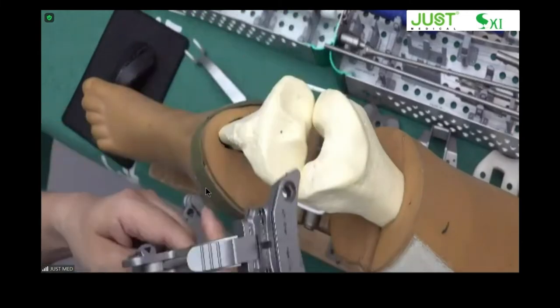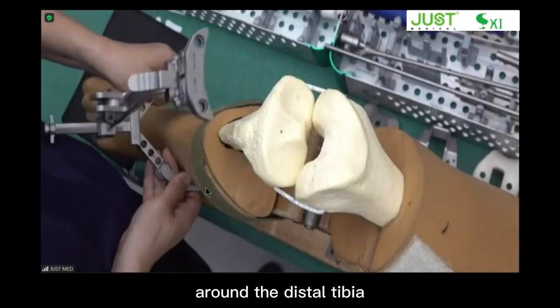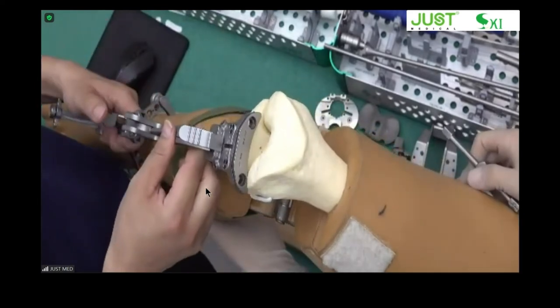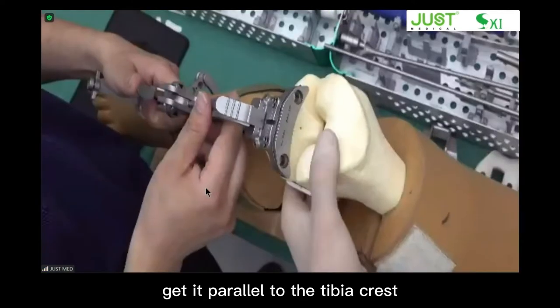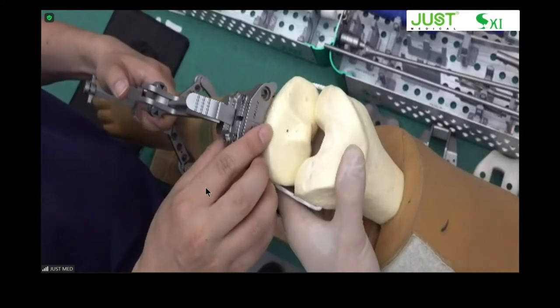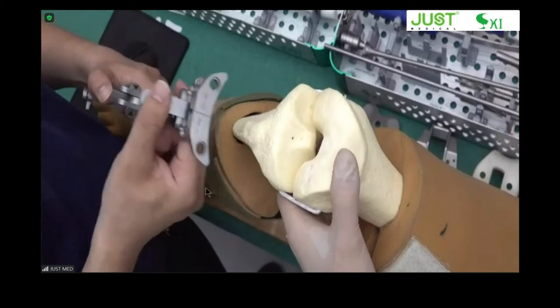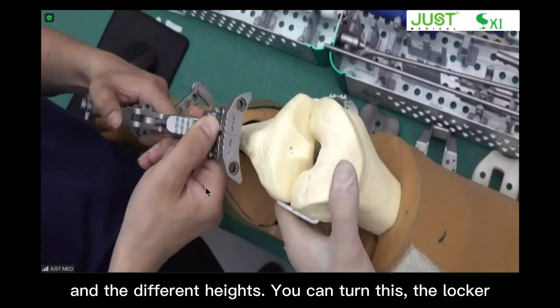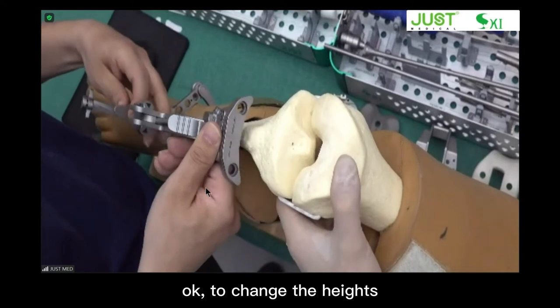Okay. So with the knee flexed, we place the arm of the ankle clamp around the distal tibia. Get it parallel to the tibial crest. Yeah, right here. So this cutting guide is adjustable in all three planes. This plane, and the valgus, and the different heights. You can turn this locker to change the height.